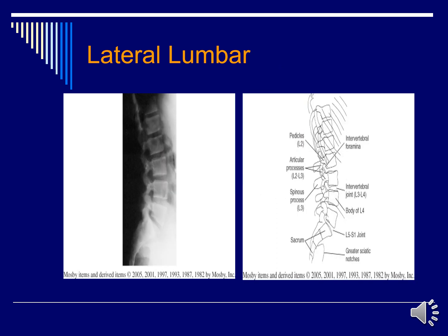This is going to be the image of your lateral lumbar. You're best demonstrating the intervertebral foramen, the bodies in profile, the intervertebral disc space, and the spinous processes. You should see no sag or no rotation on your patient.